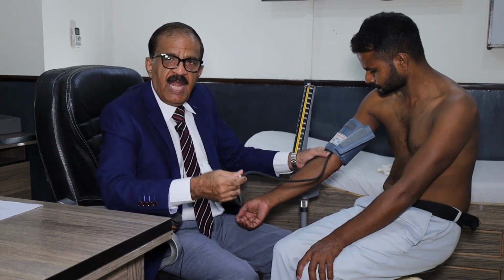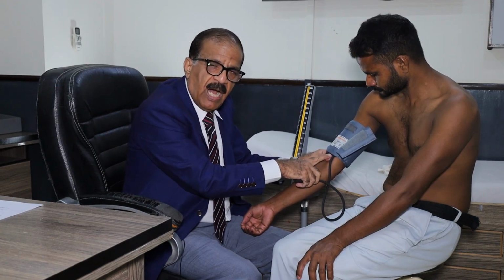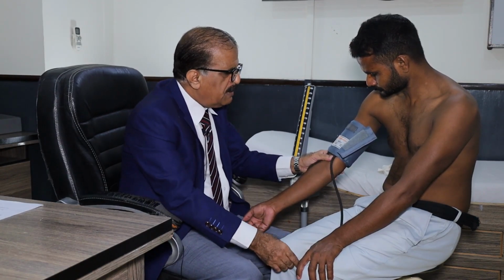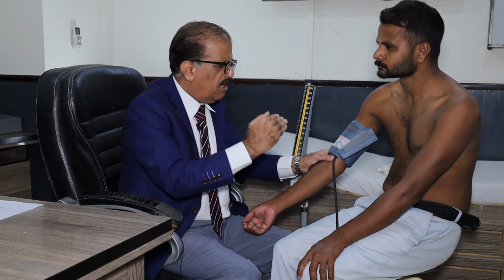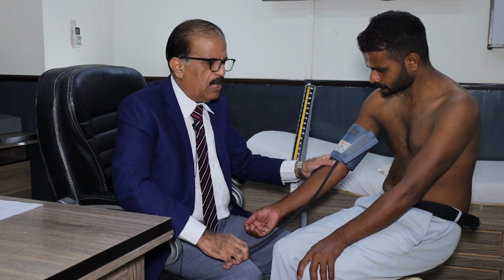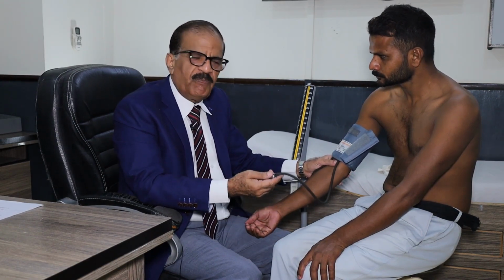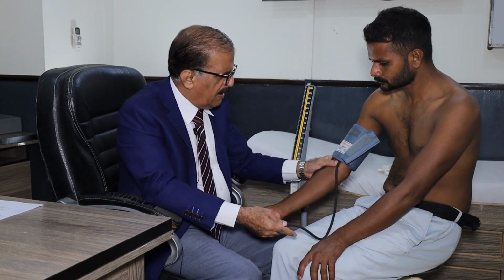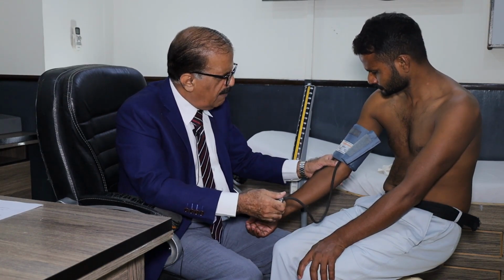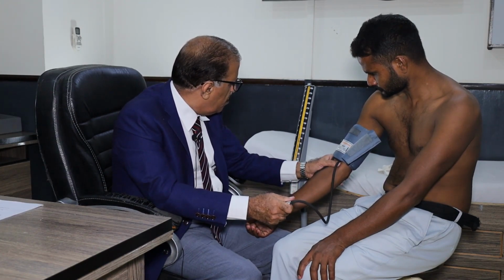I will inflate the cuff like this and will keep feeling the brachial artery, brachial pulse. Once pressure in the cuff exceeds the pressure in the brachial artery, the artery will collapse and the pulse will disappear. So that way we will estimate the systolic pressure. We will not be able to determine the diastolic pressure with palpatory method. But it is important to do this method before you proceed with the auscultatory method. So I am gradually inflating it. See, this is inflating. I can still feel the pulse, and I am looking at the BP apparatus.